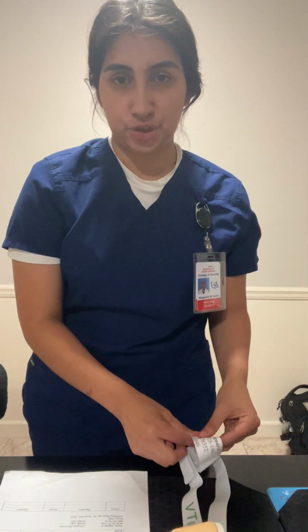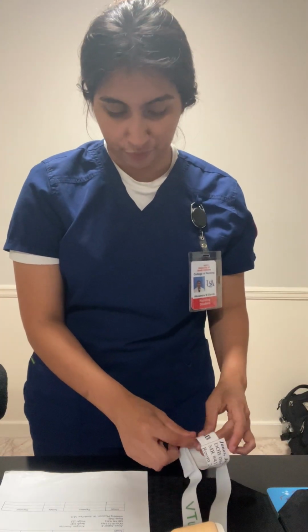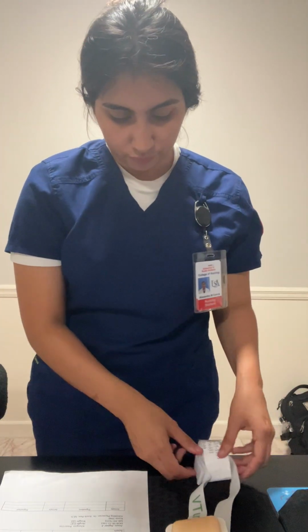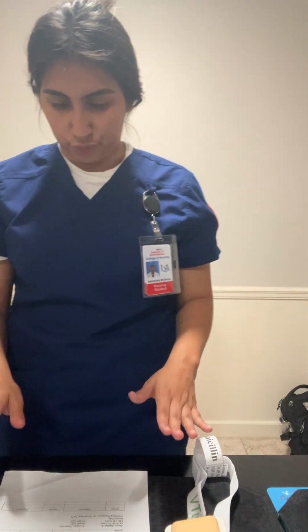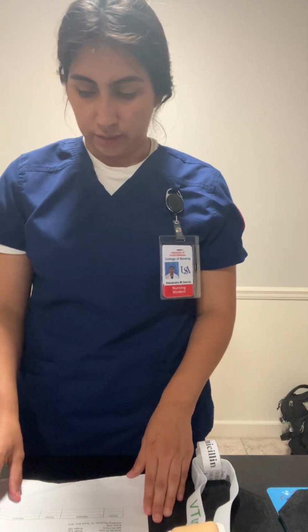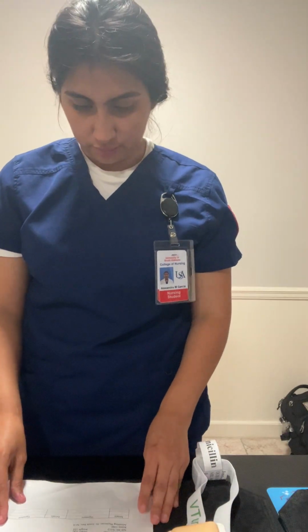Now I'm going to perform a blood sugar assessment on him before, and now I'm going to do the right medication.